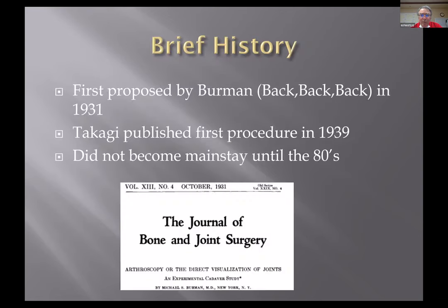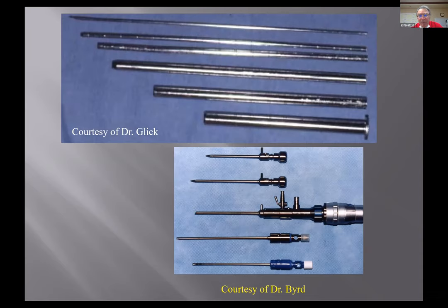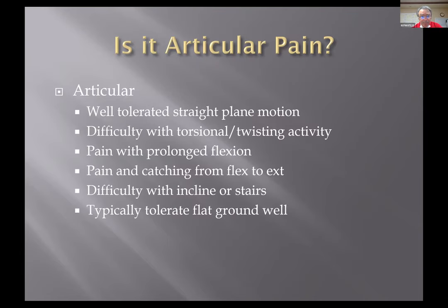So if you look at the history of hip arthroscopy, it even goes back further to the early 30s, some of the first published literature. But really, it was the 80s. A guy named Jim Glick came up with some of these switching sticks that gradually enlarged the opening for you to get into a joint. And then some of the cannulas and scope options that were adapted from knees and other joints were then started on hips. The problem is, you can see they weren't very long.